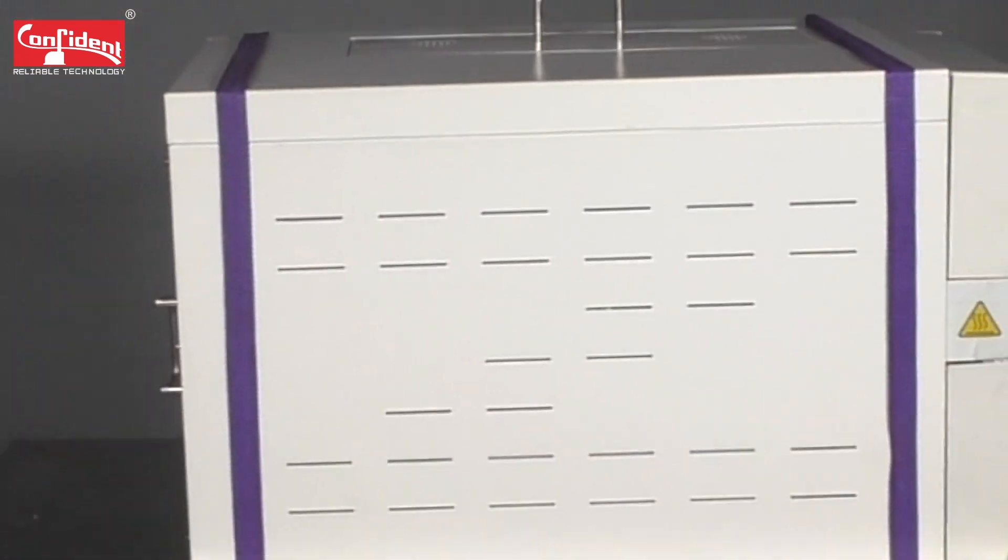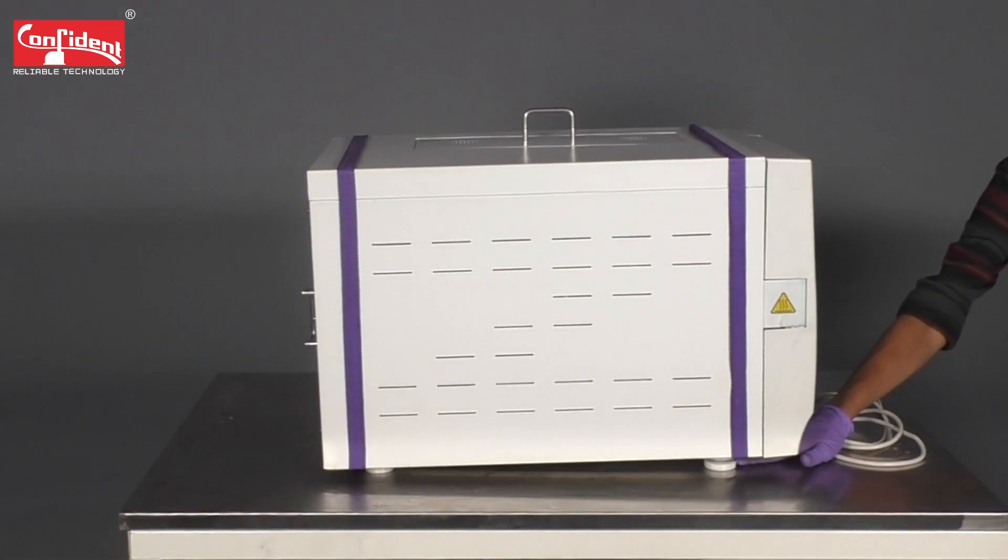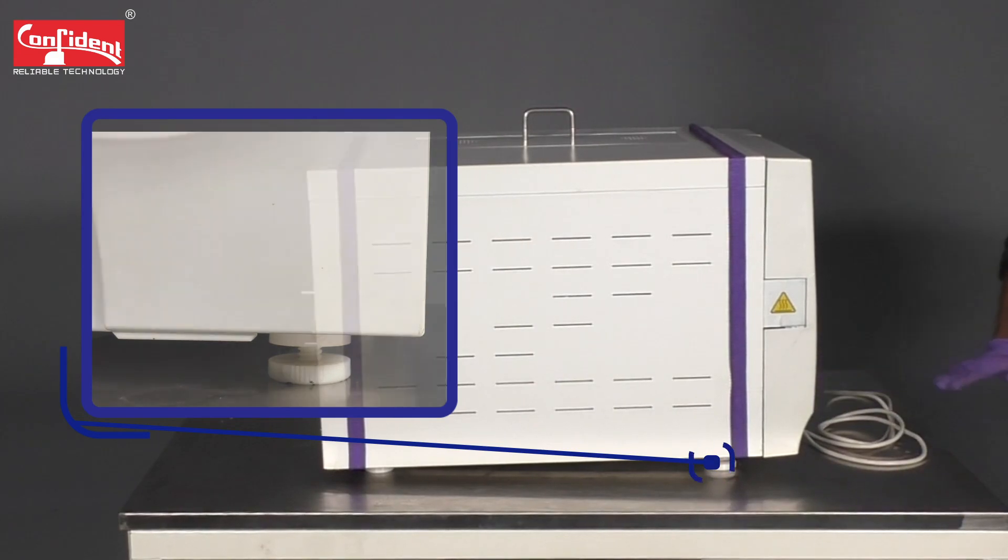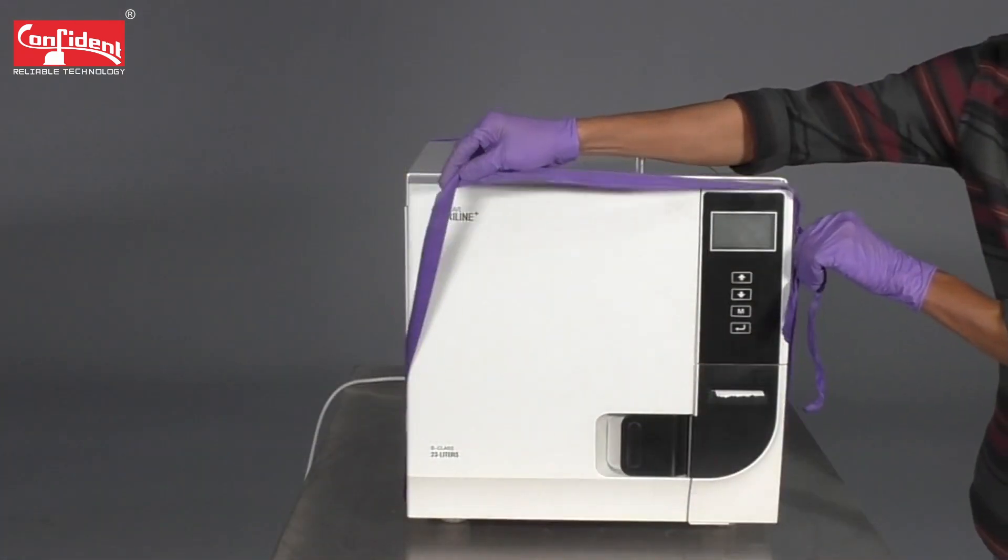Once you remove the device from the packing box, use the safety belts attached to lift the autoclave and place it on a flat table or any flat surface. Use the adjustable bushes to increase the clearance of the device from the surface or to level it properly. Insert the power cable to the device and remove the belts.